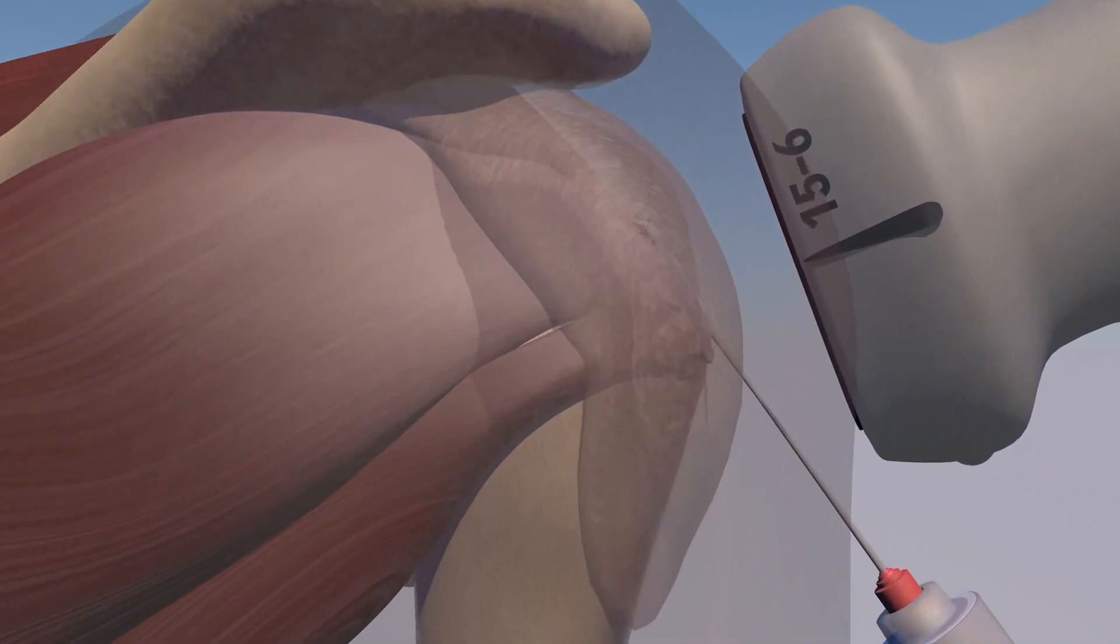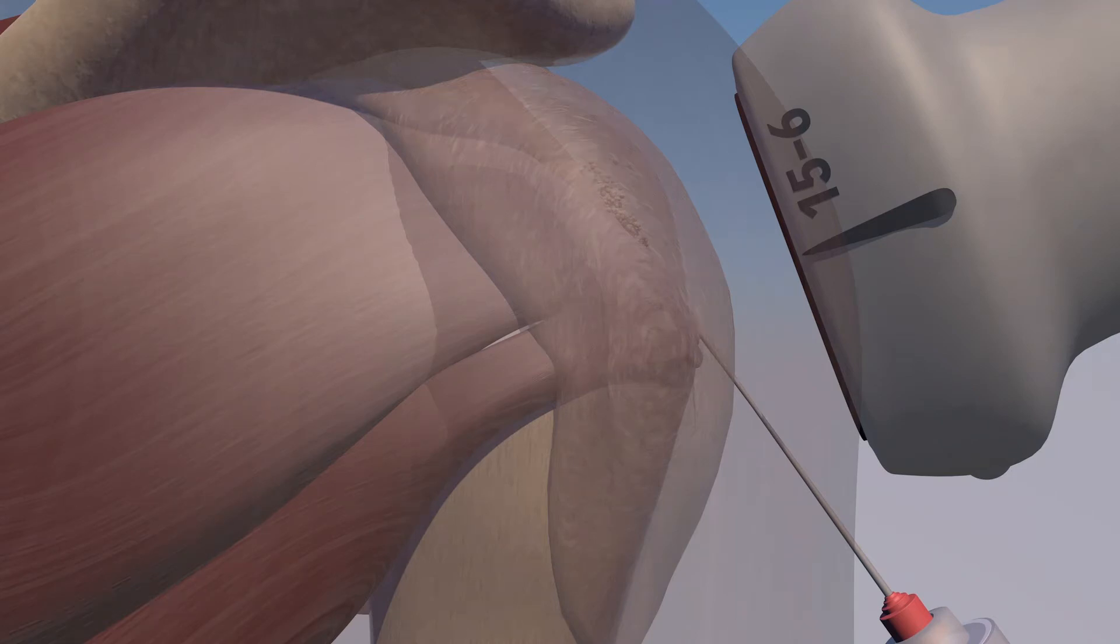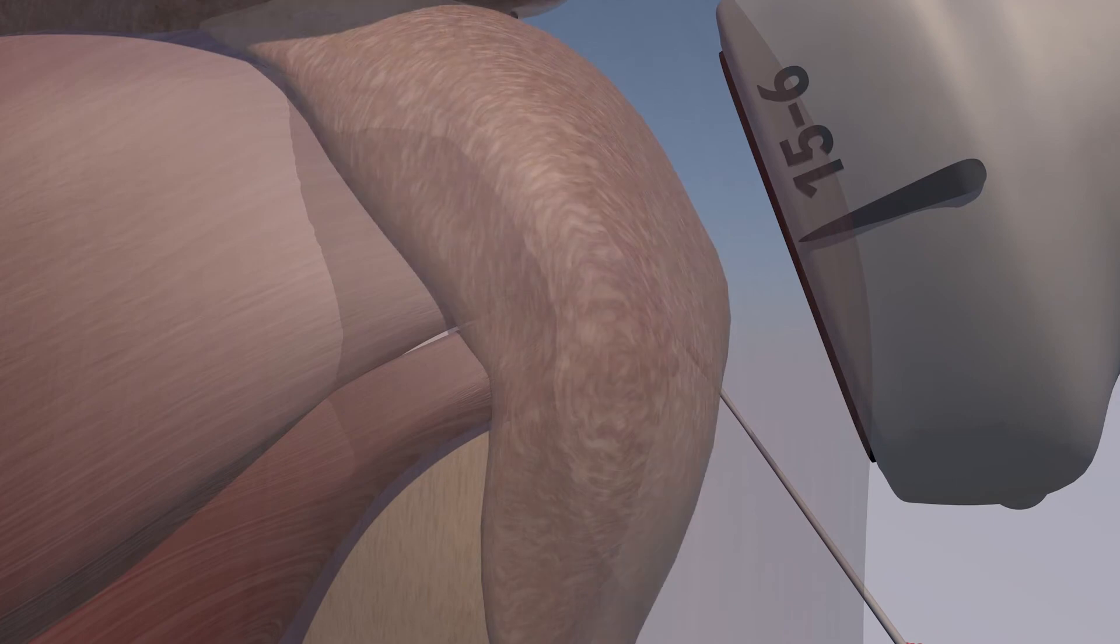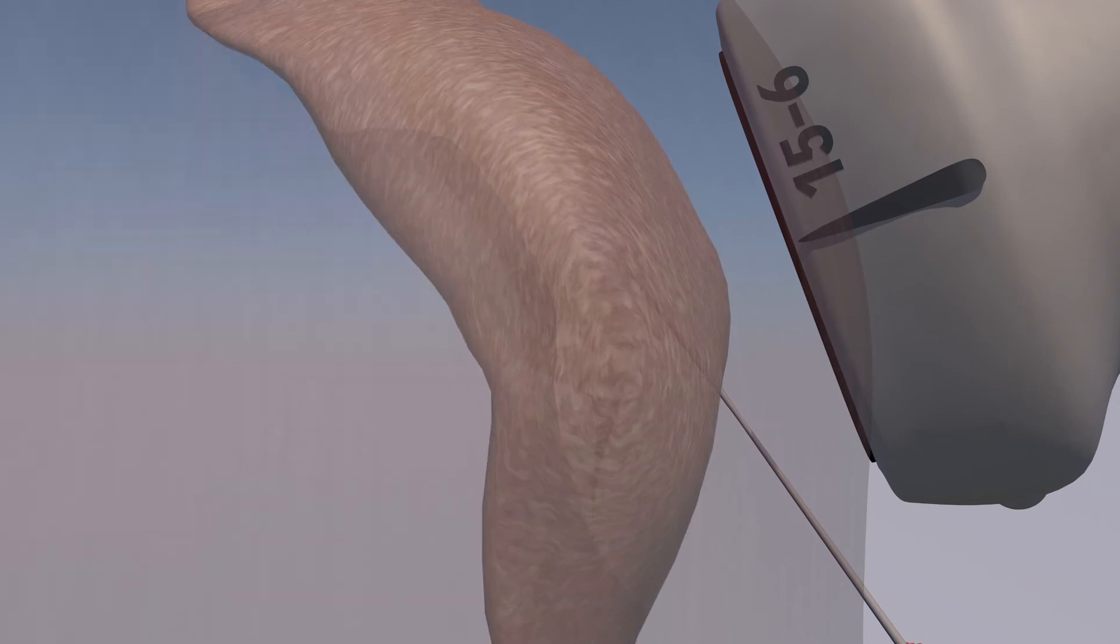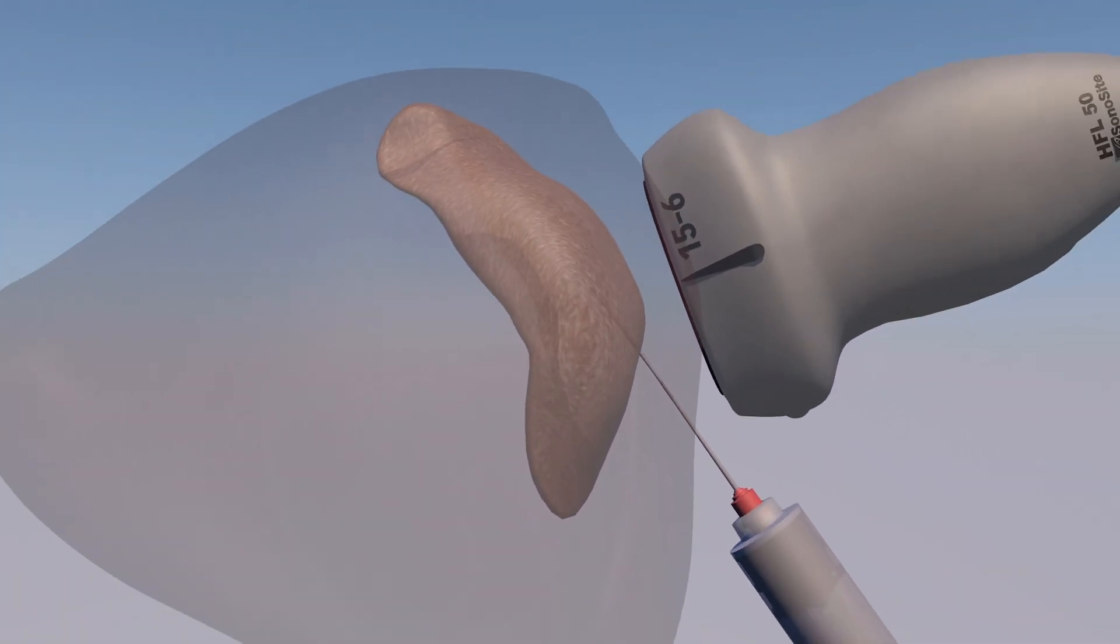And again, here's the needle going in and here's the injectate. You can see it going within the bursa itself. And now you're going to watch as the bursa gets a little bit spread out as the injection continues and it's pushing up against the deltoid muscle.